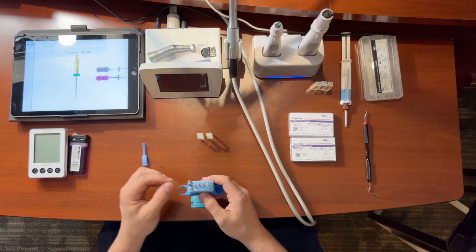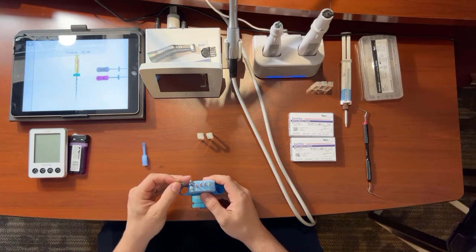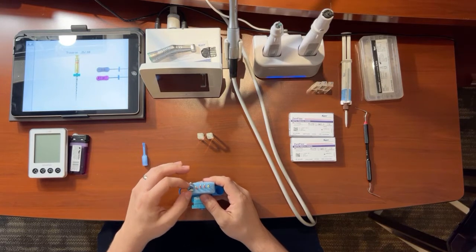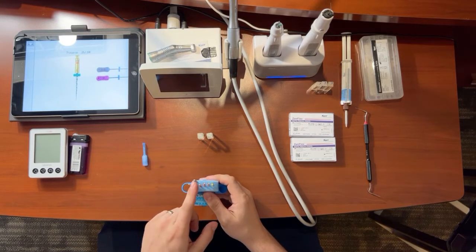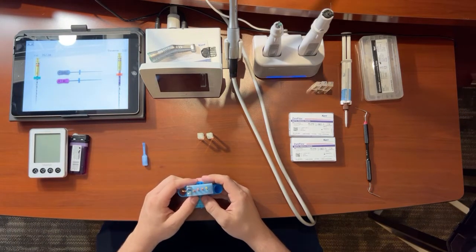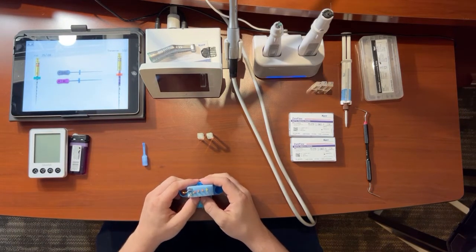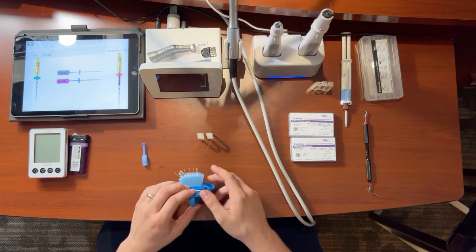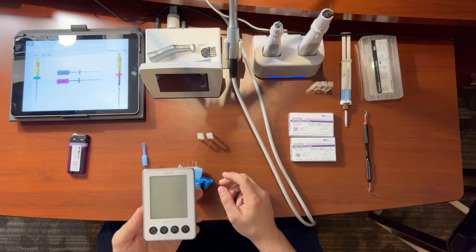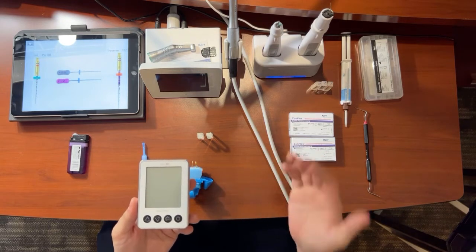After you've used this orifice opener to open up your orifices, then you will use these hand files here. You will use 8, 10, maybe even 15 or 20 to establish your working length. And you will use an apex locator. We have the apex ID, which is calibrated off the front end.